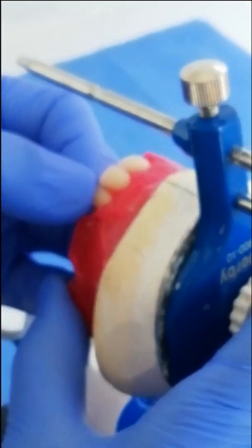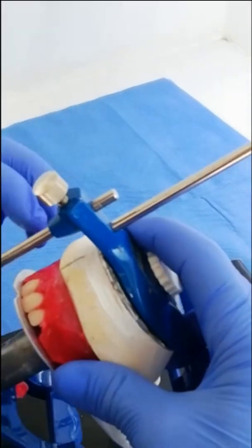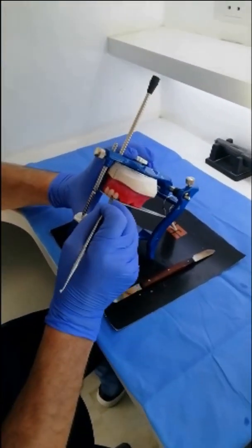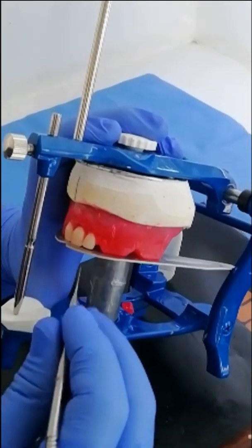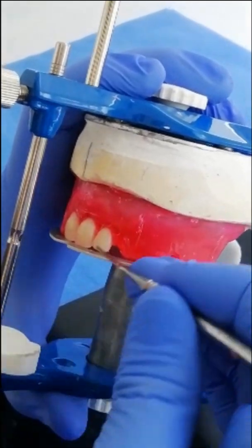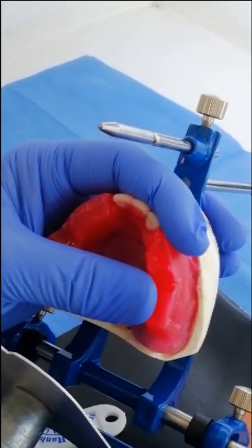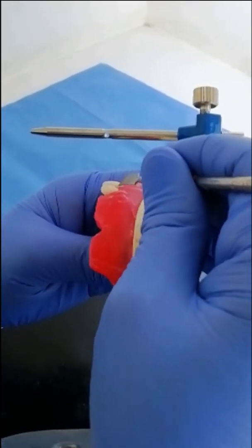As long as the wax is soft, you can control the position of the tooth. It is a little bit higher than the central. In the labial view, the long axis of the lateral is more inclined distally at the neck. The incisal edge is parallel to the occlusal table but not touching it — there is about half a millimeter space between the incisal edge of the lateral and the occlusal table. In the occlusal view, it is restoring the contour of the wax rim as customized in the patient's mouth. In the profile view, the neck of the lateral is depressed more than the neck of the central incisal.